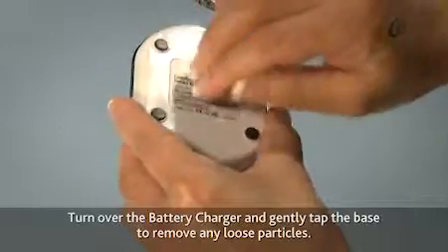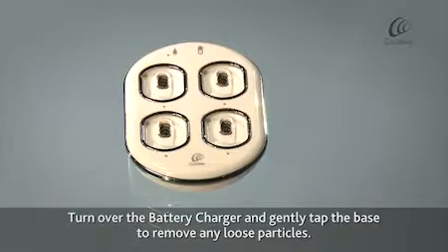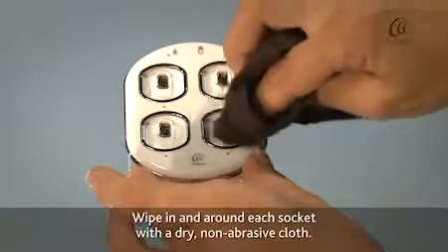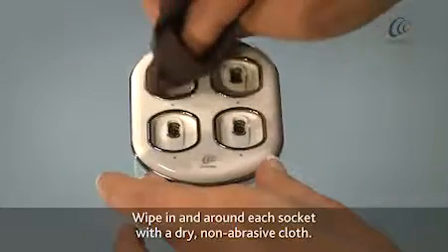Turn over the battery charger and gently tap the base to remove any loose particles. Then wipe in and around each socket with a dry, non-abrasive cloth.